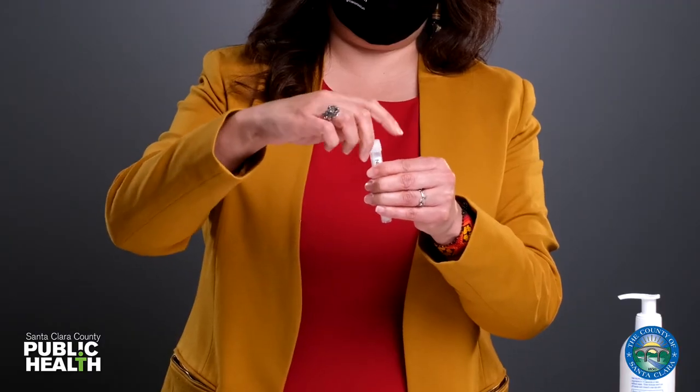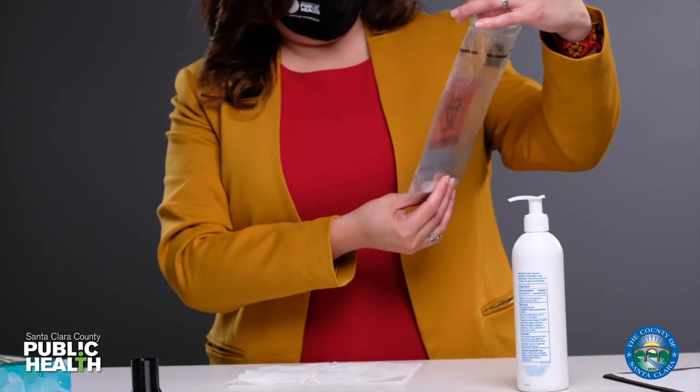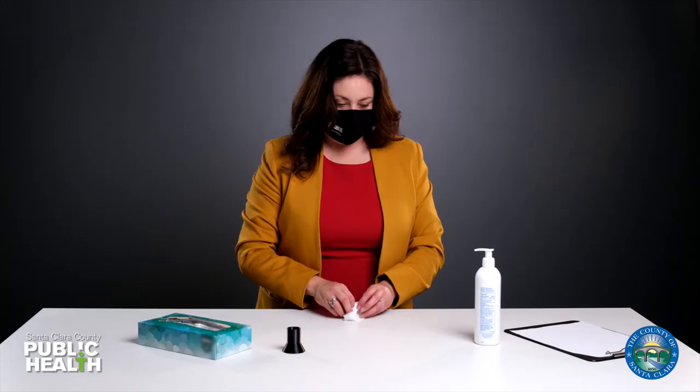Screw on the lid and place the tube into the bag, making sure your name and date of birth is correct. Zip up the bag to secure your test tube. Place the bag in the basket and toss the remaining trash.